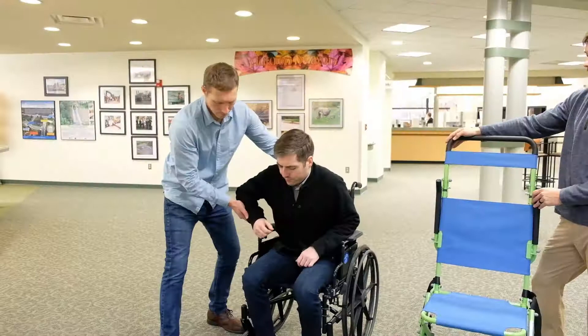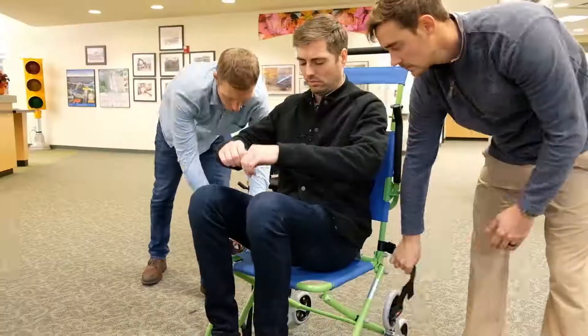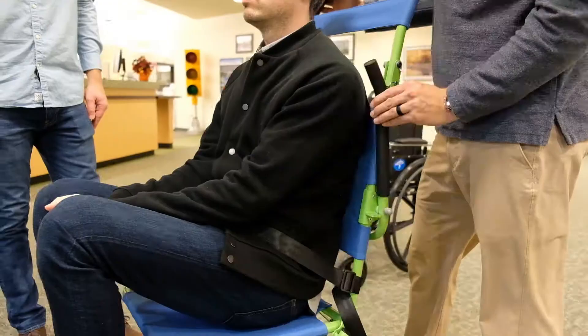Transfer the person onto the seat according to your personal emergency evacuation plan. Make sure the chair is supported while you do so. Fold out the footrest if required, fasten the safety belt and pull down the armrests.